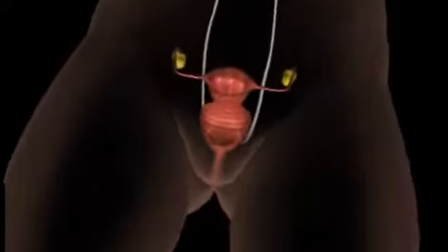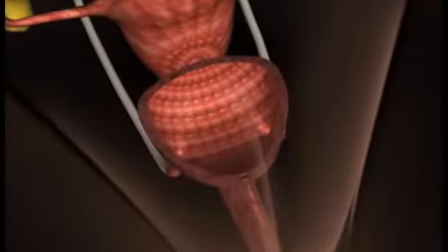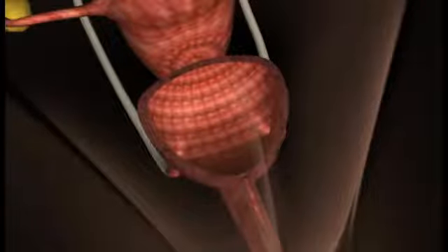The simple procedure consists of a number of small injections into the wall of the urethra close to the bladder neck. A cystoscope is introduced into the urethra.